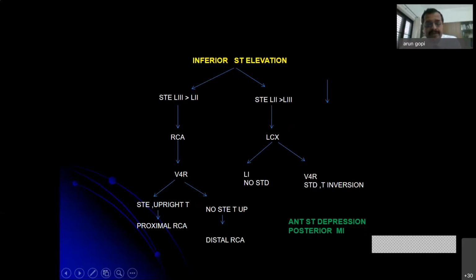On the other hand, if you have ST elevation across all the precordial leads in a relatively seemingly stable patient, this is a benign entity, what we call pericarditis, where you have a concave ST segment elevation. As I said, in myocardial infarction, you have convex ST segment elevation. In pericarditis, you have concave ST segment elevation. In different vascular territories, you will have ST elevation in inferior and anterior leads without reciprocal ST segment changes. And the most specific sign of pericarditis is to have PR segment depression in all the leads except for AVR and V1, where you have PR segment elevation.